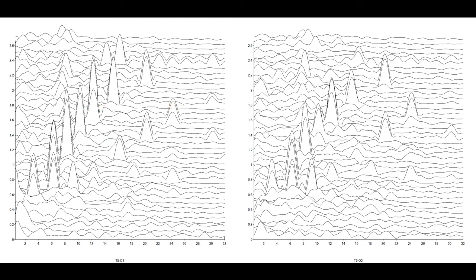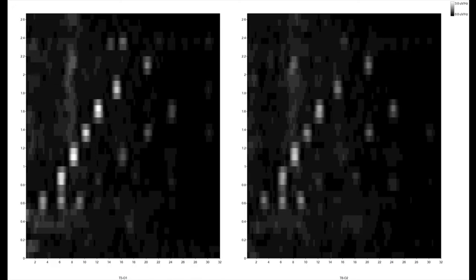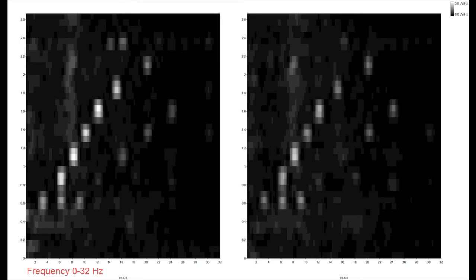A CSA begins to approach the compact depiction of the FFT spectra provided by the spectrogram. If, instead of representing the FFT spectrum by a line graph, we substitute a color scale to represent the amplitude of the graph on the z-axis, a spectrogram results. This is also sometimes called a density spectral array, or DSA.